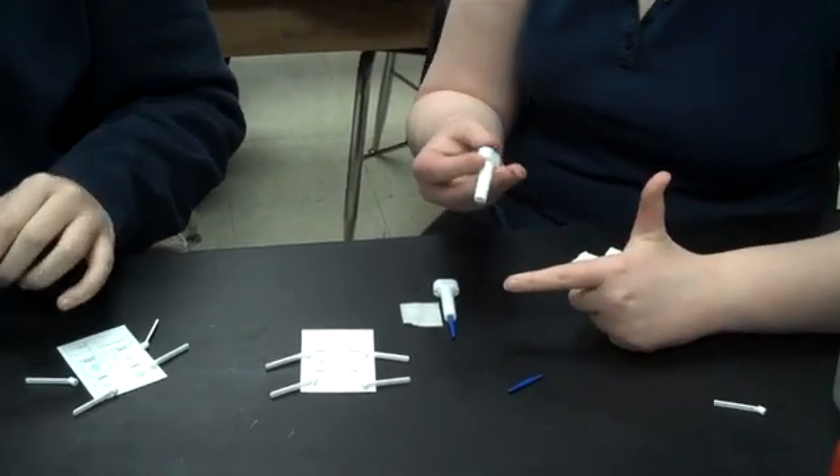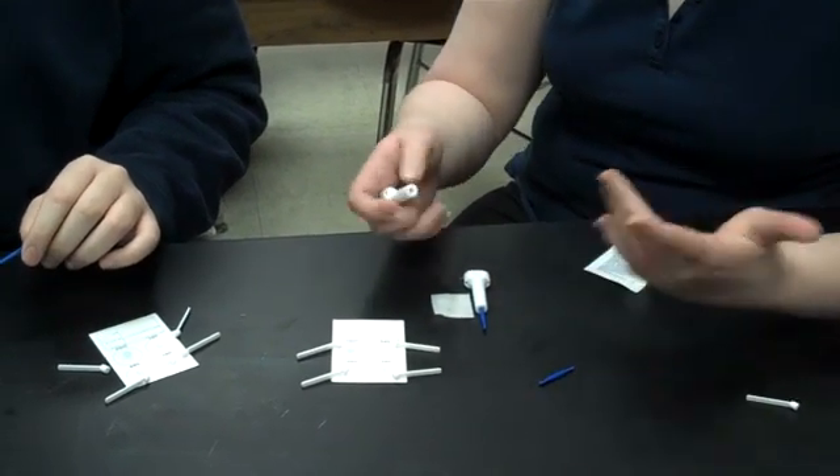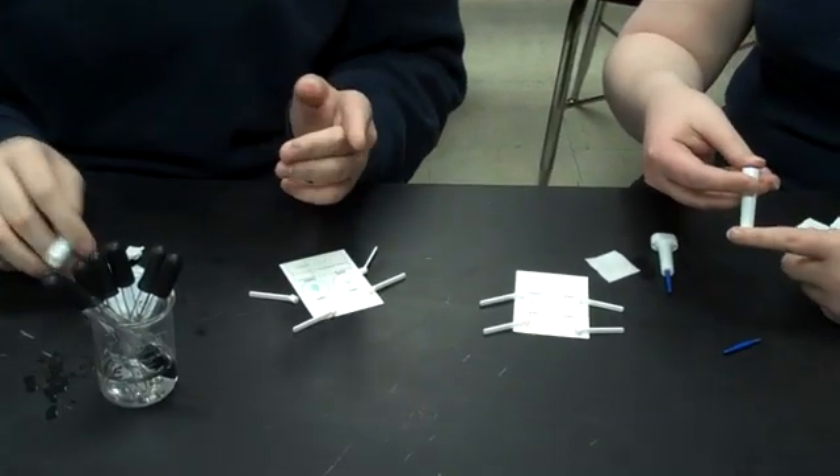You probably want to wait. You might not want to use your index finger because it makes your finger sore, but it doesn't really matter. I usually like the ring or the middle finger.